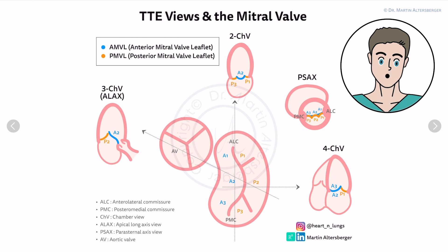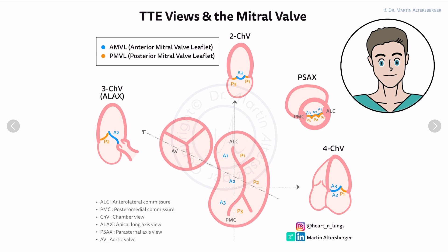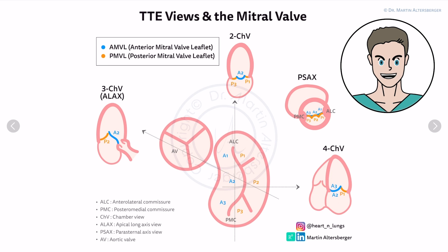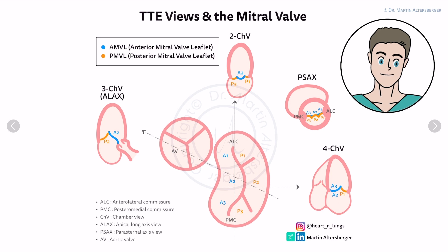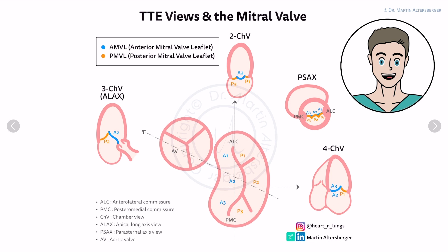In the last video about the parasternal short axis view, we looked specifically at the aortic valve and how to obtain the parasternal short axis view. We evaluated the tricuspid and pulmonic valves as well as the pulmonic trunk and pulmonary arteries. In the last video, we stopped at the evaluation of the mitral valve, and now we dig deeper into the topic of the mitral valve.